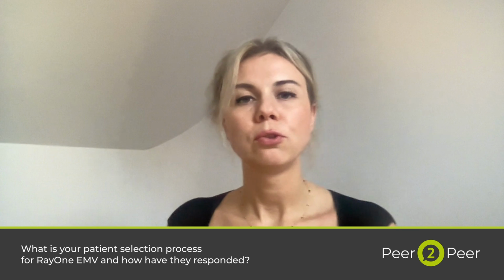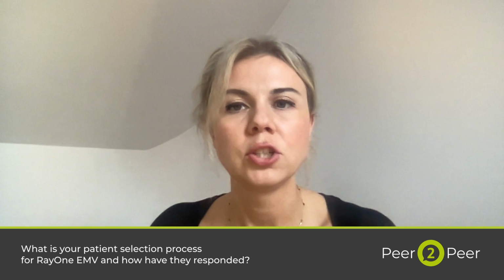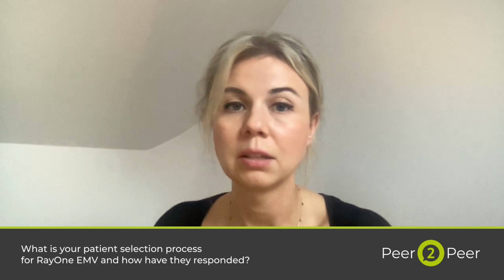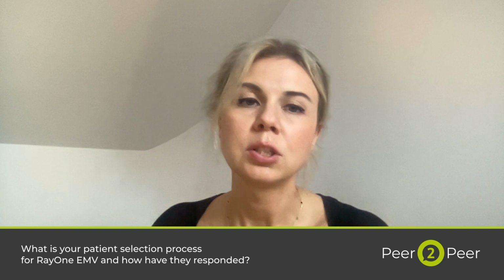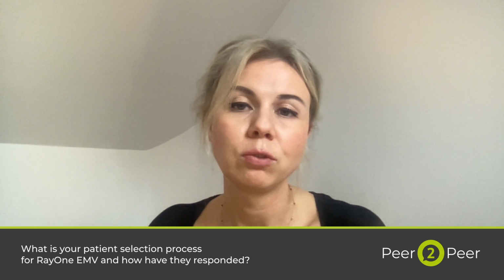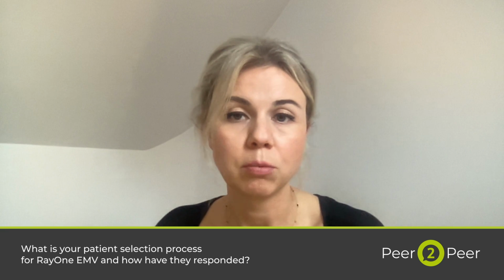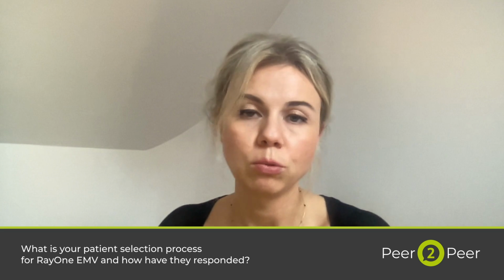The selection of patients for EMV is much easier than for multifocals for me. Of course, patients cannot achieve such good near vision, but intermediate vision is satisfactory, in combination with micro-monovision. They can be independent from glasses in the majority of situations. And what is most important, the lack of dysphotopsias makes this lens appropriate for patients with high demands on quality of vision, especially night vision, where small reading glasses are not a big problem. I use EMV as a standard monofocal lens with the same approach.